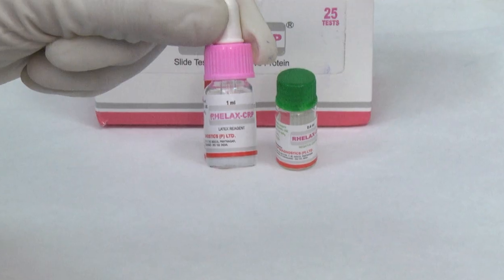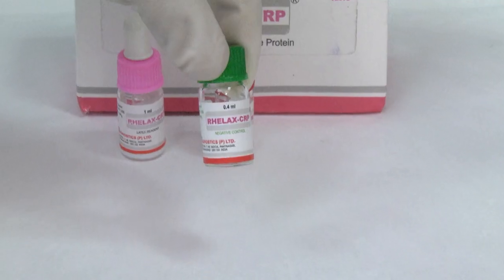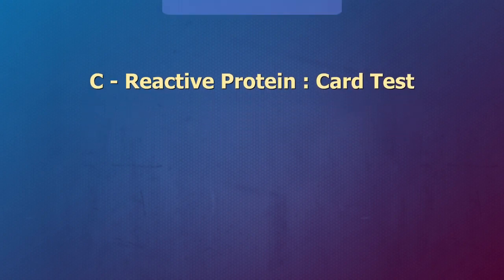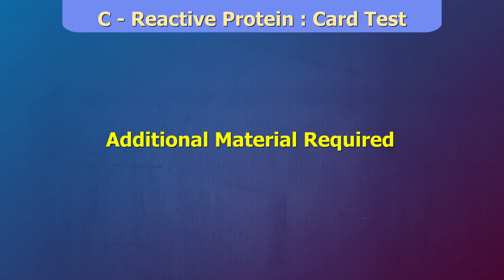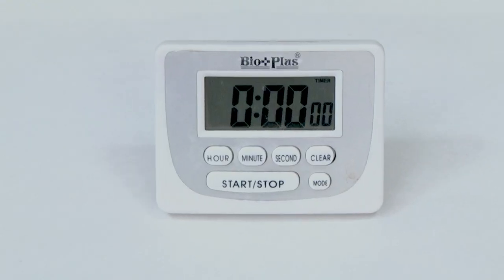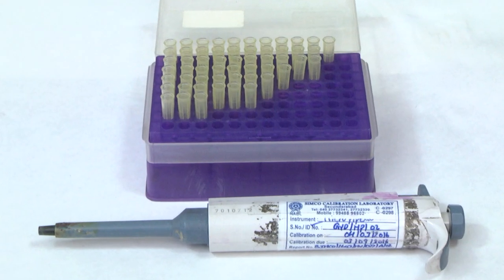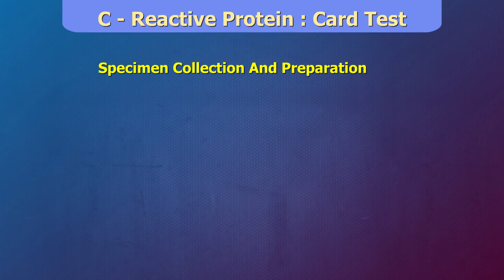Reagents: CRP reagent. It is a uniform suspension of polystyrene latex particles coated with anti-CRP antibodies. Positive control. Negative control. Reagent storage and stability. Store the reagent at 2 to 8 degrees centigrade. Do not freeze. Do not use reagents after the expiry date. Additional material required: stopwatch, test tubes, isotonic saline, pipette and tips, mixing sticks.